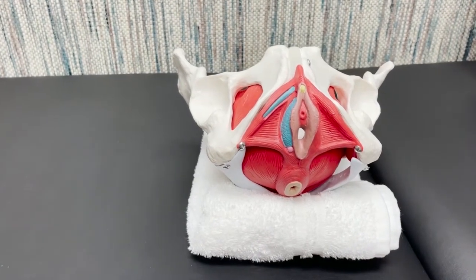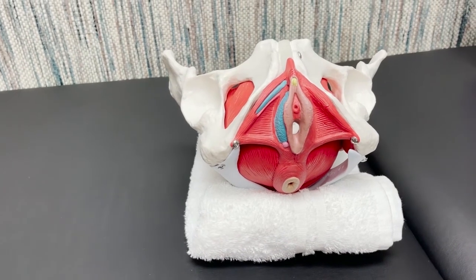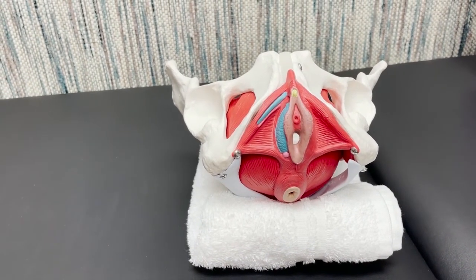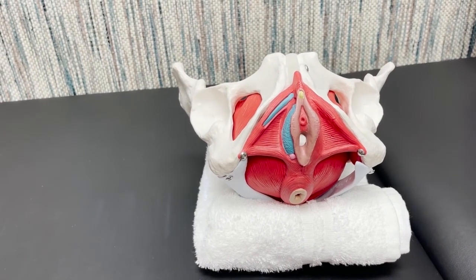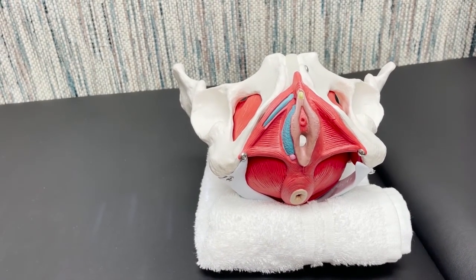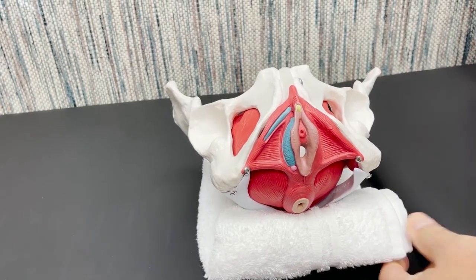Needle length is going to be less than 30 millimeters, and our backdrop here would need to be a finger approximation. Precautions here: the rectum, the vaginal canal, urethra, inferior rectal neurovascular bundle. So for our purposes of our lab, we will discuss this. We will not demonstrate this.